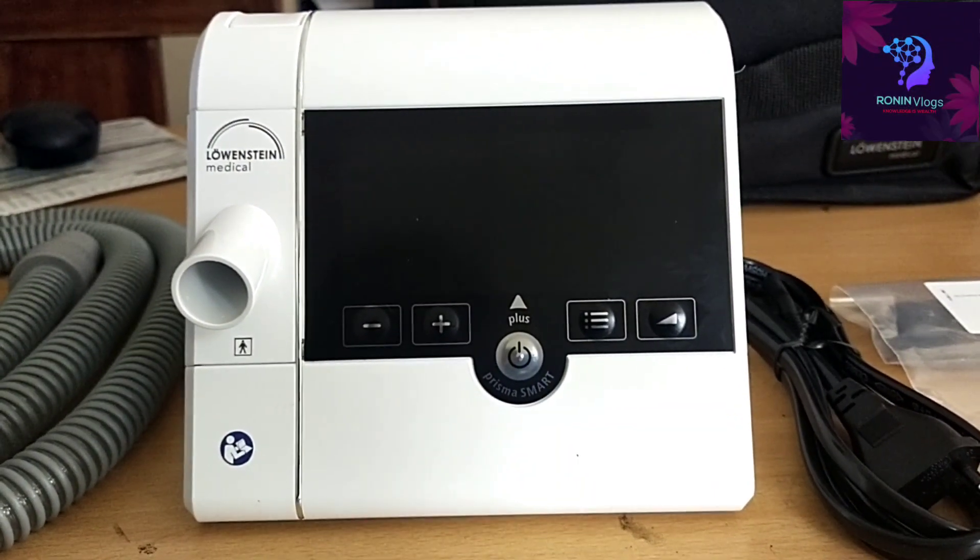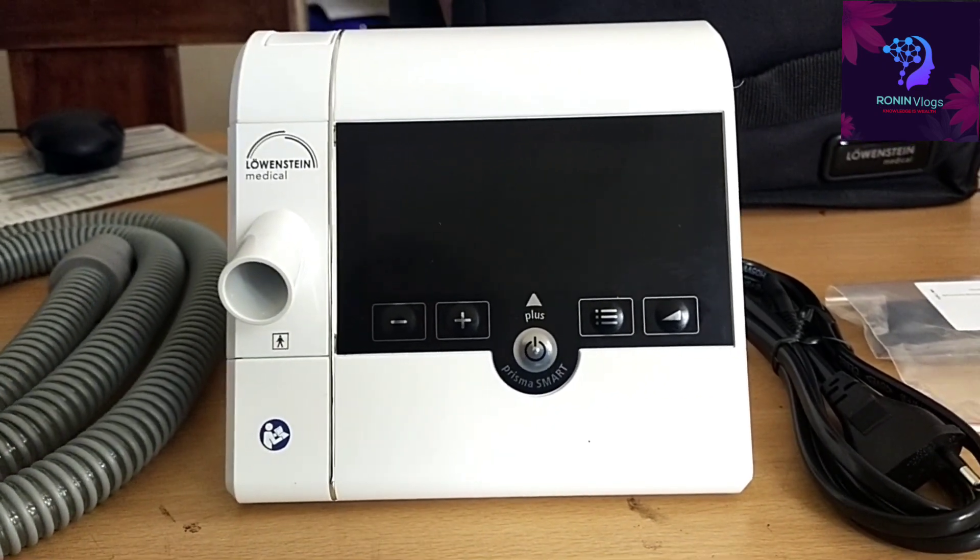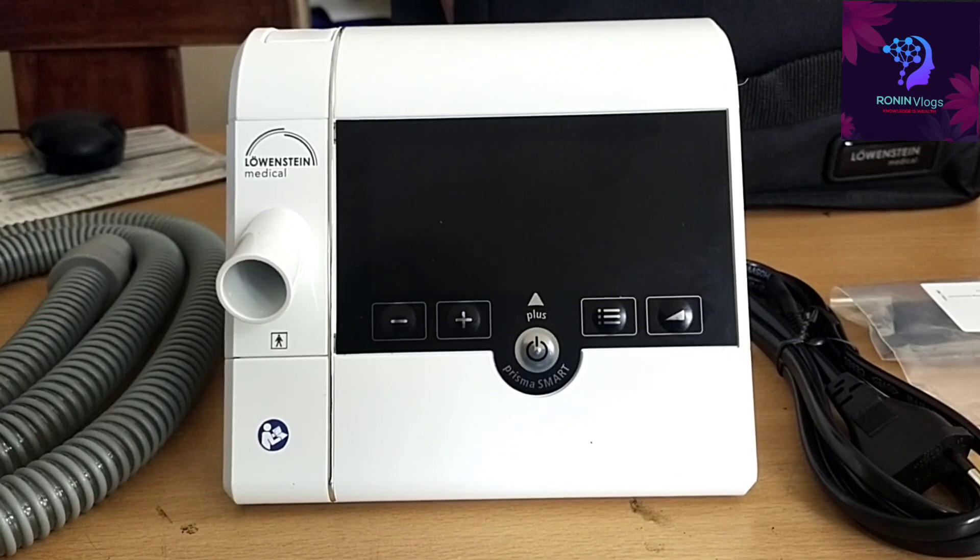Hello friends, welcome to my YouTube channel. In this video I am going to show you about the Lovisin CPAP machine. CPAP means Continuous Positive Airway Pressure.